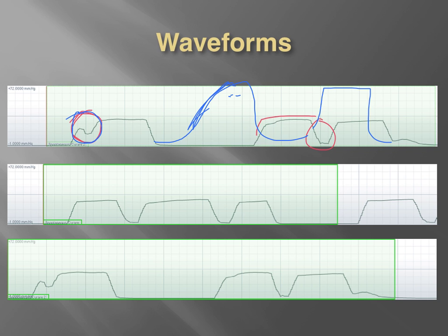Okay, so we may actually need to use that clue for the Curare cleft or the interruption in respiratory pattern, which we see here, where this might be manual ventilation, whereas this here and this here may actually be the patient that is trying to breathe on their own. If we see this with that excessively high end tidal level, then we may need to not necessarily just consider extra medications, but do we need to correct this abnormal level of carbon dioxide floating in the bloodstream and in the lungs.